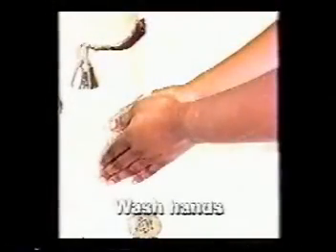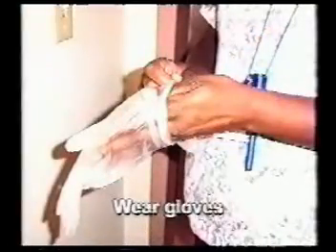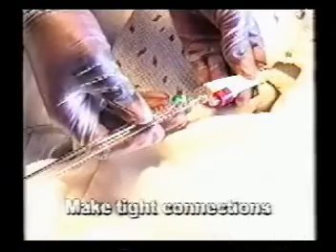The responsibility of the caregiver when giving a patient care: they must wash their hands before and after handling catheter equipment. They must apply gloves before handling a catheter, making sure that all connections are tight to prevent leakage from the catheter and prevent germs from entering the drainage system. Remember never to disconnect the urinary tubing from the catheter without permission from the nurse.